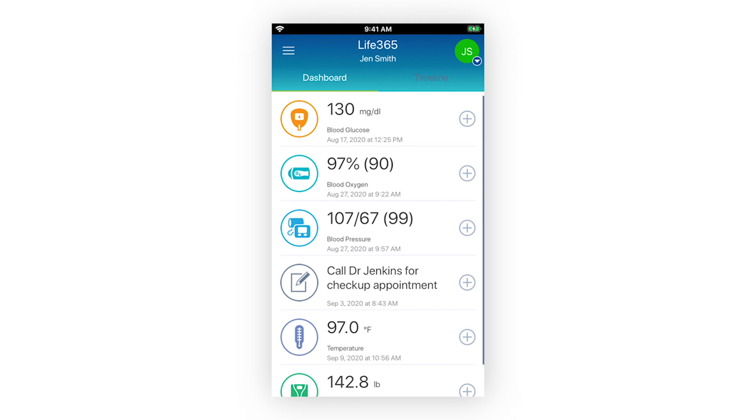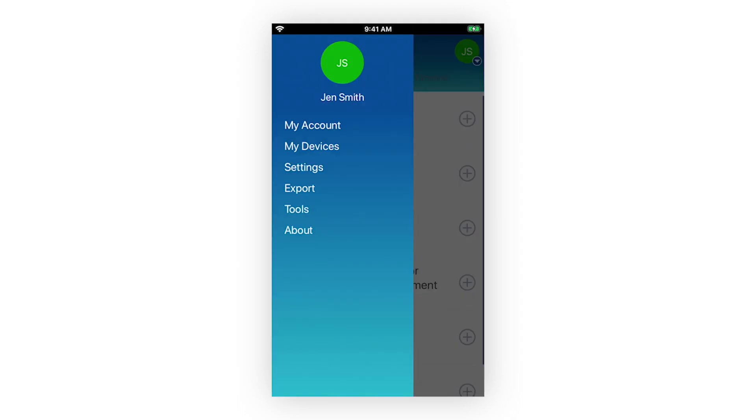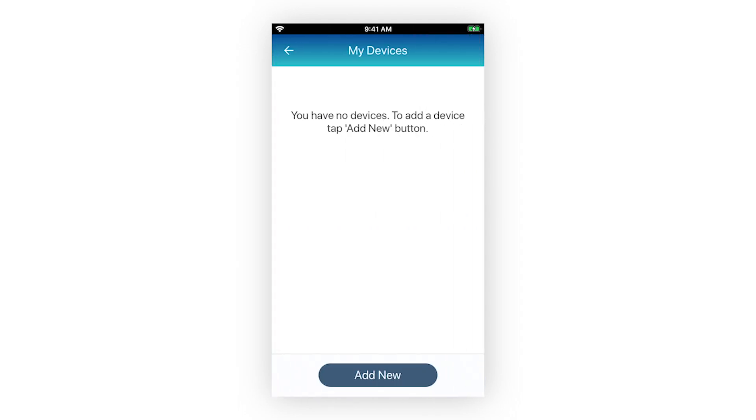To pair Bluetooth medical devices to your account, access your account settings by selecting the hamburger icon located in the upper left of your account screen. Select My Devices.